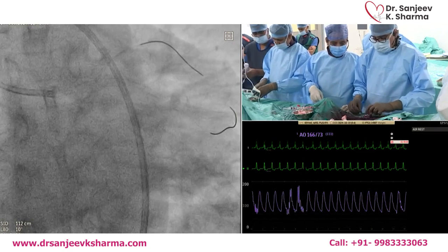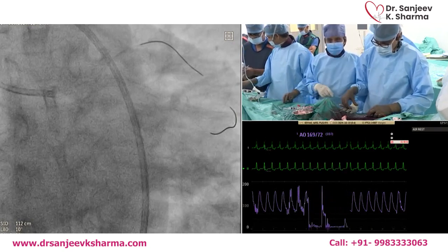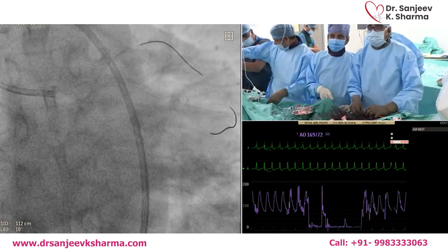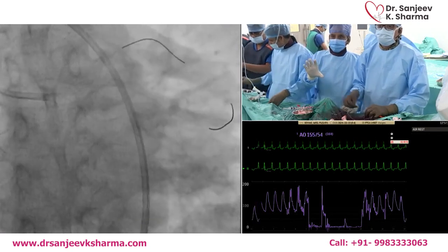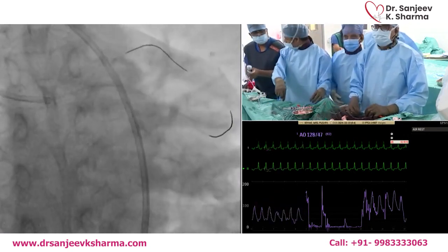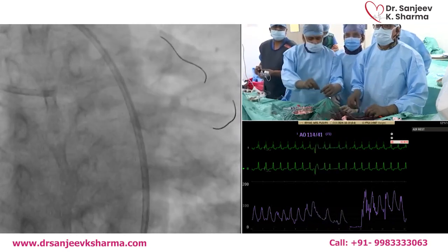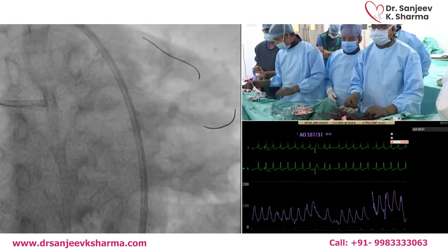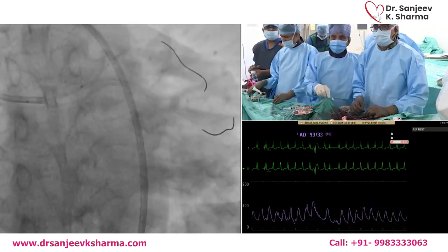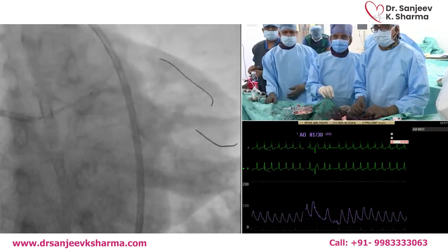So I think what happened is, at the time of the imaging, we established where we are going to see the ostium, and we found that this view, which we are working in, is the one view where we will be able to see even the ostium. So we went exactly there, and the calcium was the marker for us also. So we are going with this because of that. Yes, if there is a doubt, you go to another view also. Yes, that is correct. Thank you.